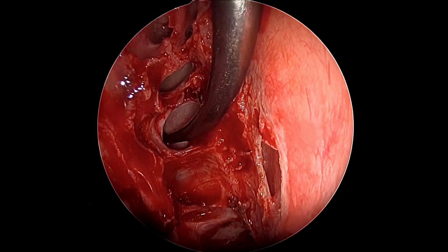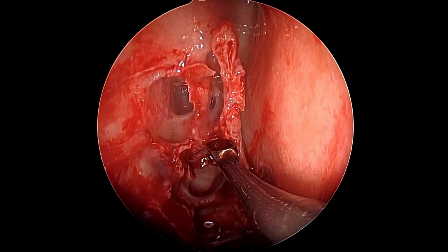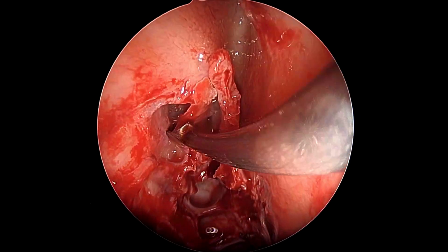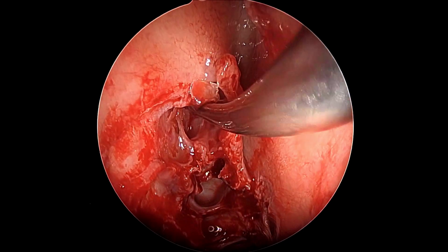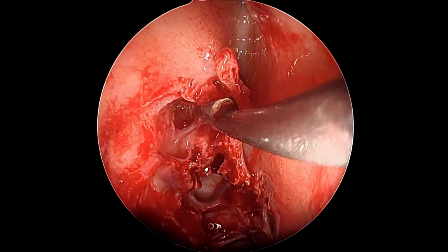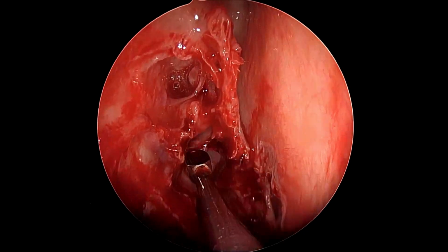Sometimes when you have Bernoulli's effect and the meningocele starts coming out and protruding from a small defect, the defect has to be often enlarged slightly to make it possible for the graft, the fat graft, to go inside. One cannot push fat graft into very minuscule openings, and that doesn't work. So here we are clearing some more bone from the frontal recess, trying to make the recess wider and patent for avoiding any sinusitis post our reconstruction.